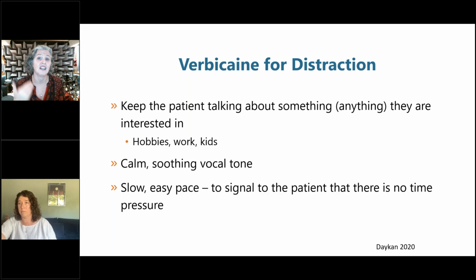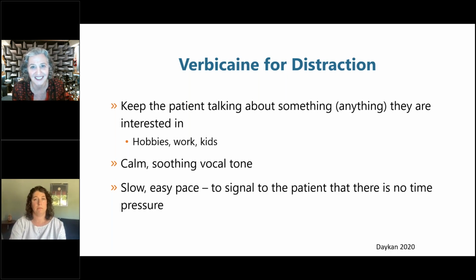You can take that cue from what their voice is saying when they stop talking, or if they slow down, or if they sort of drift off a little bit. You might notice that they're starting to have a vasovagal reaction. So keeping them in the conversation, if they are open and willing, is really helpful for a whole lot of reasons in addition to distraction, but only if they are open to it and willing to do that.